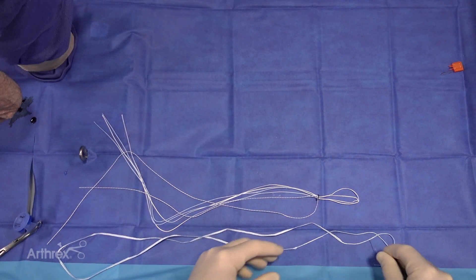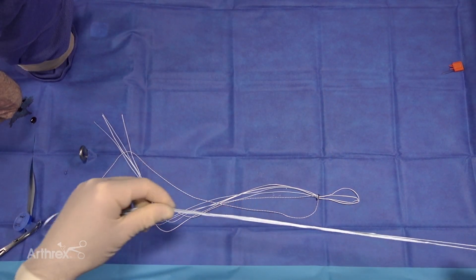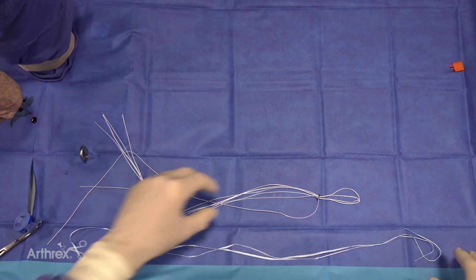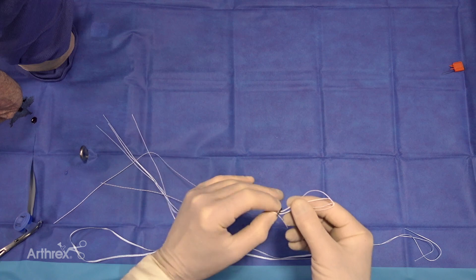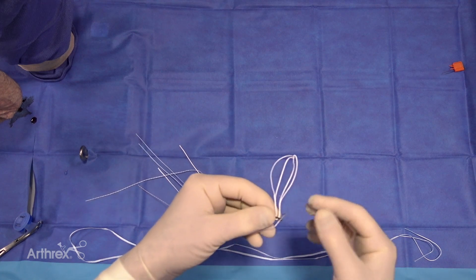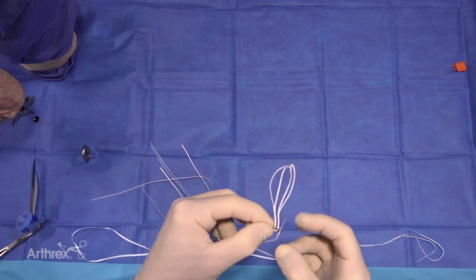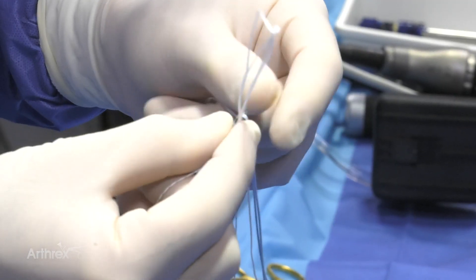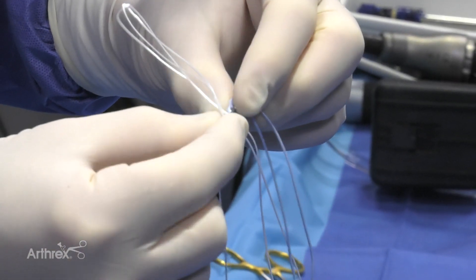The first thing we need to do is load our long fiber tape through our button. For the independent internal brace, we're going to use the double loaded tightrope, which has a number two tiger wire passing suture, and there's also a number five through this second hole here.